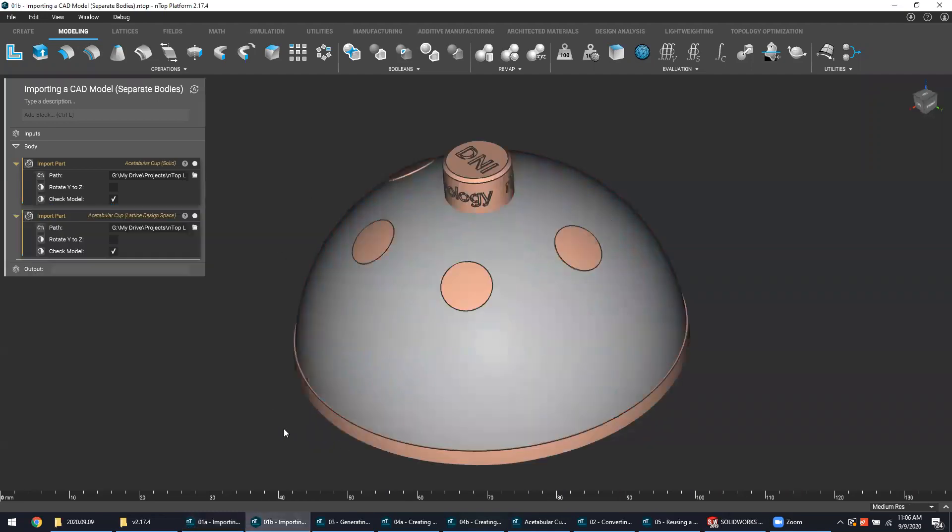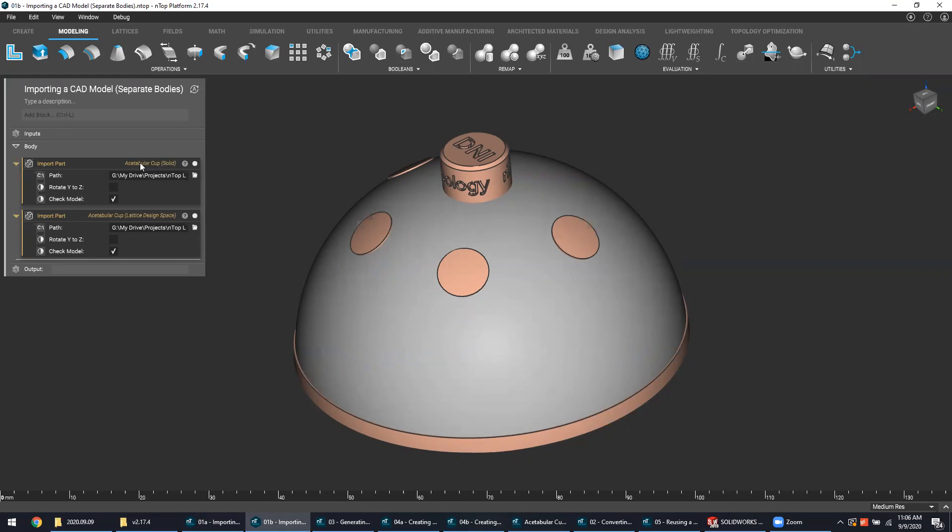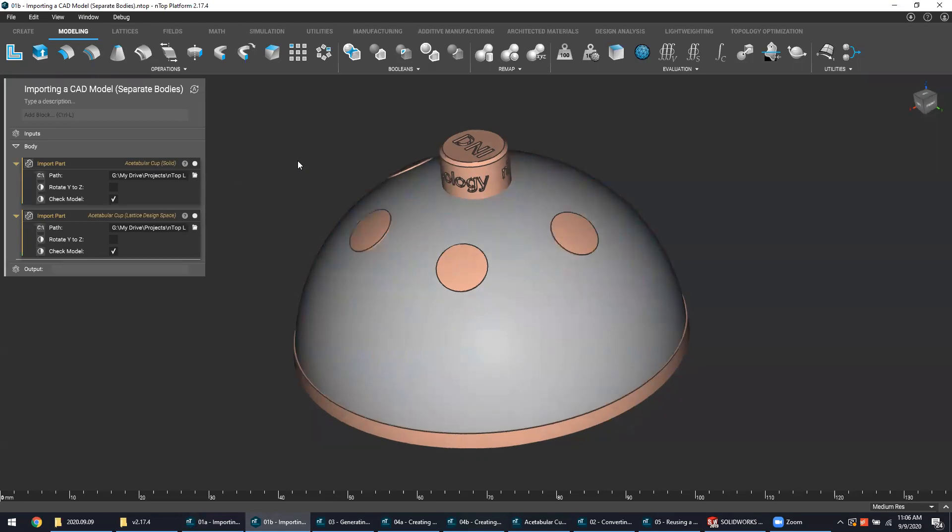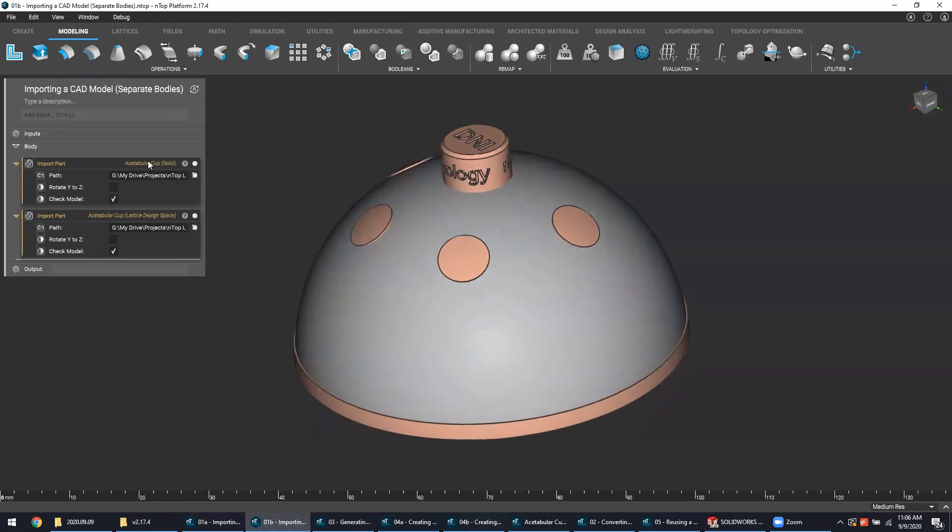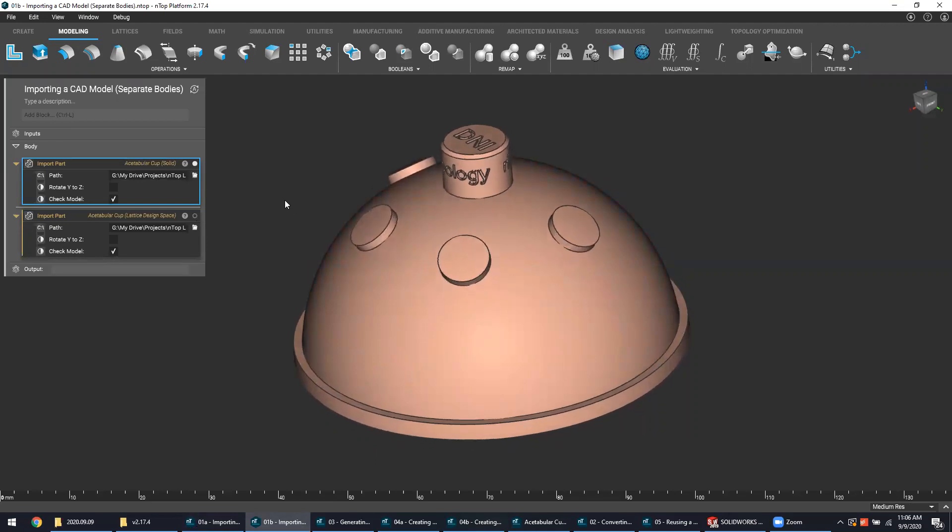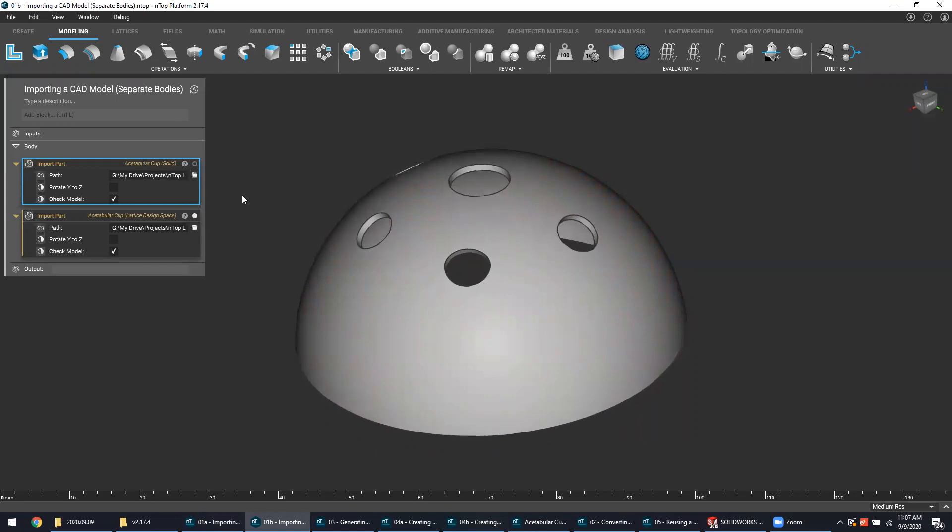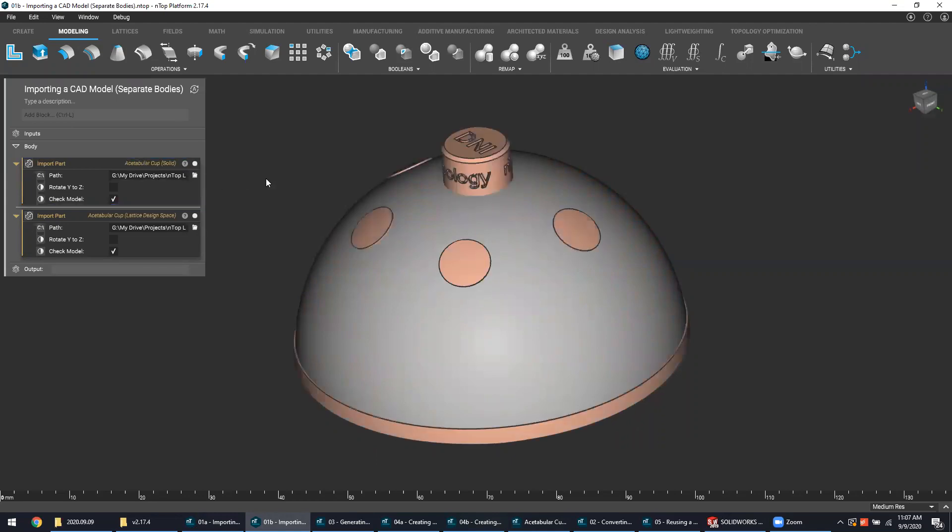In this example, I actually have the same exact part, but I chose to export the two discrete bodies as two separate parasolid files and then import them into NTOP as two separate blocks. This one represents the solid and this one represents the lattice design space. There are minor nuances between these importing strategies, but at the end of the day the results should be the same and it typically comes down to preference.